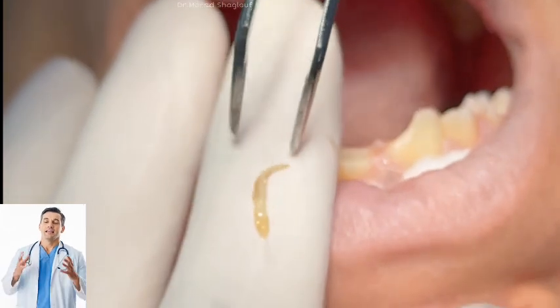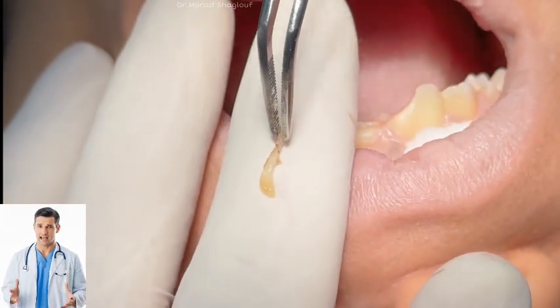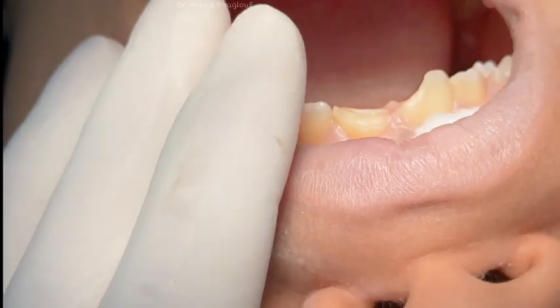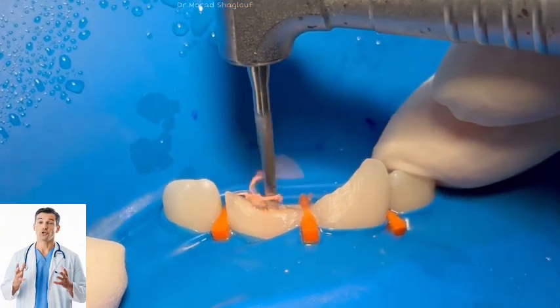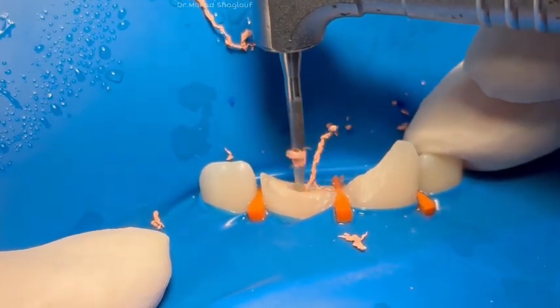Today's video shows the process of rebuilding anterior teeth using a fiber post. The patient presented with severely damaged front teeth. Due to extensive decay and loss of tooth structure, the remaining teeth were no longer strong enough to support a direct restoration on their own.